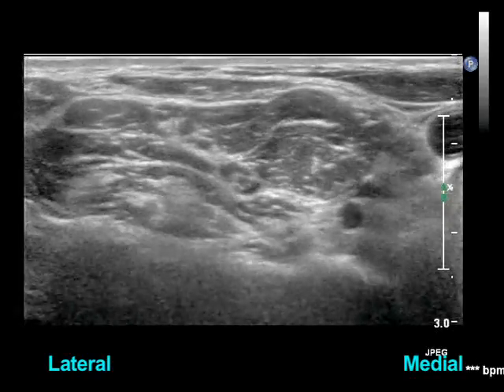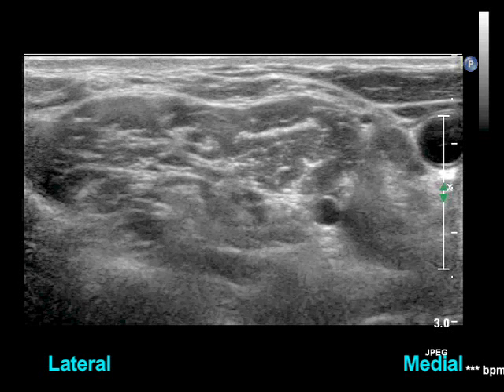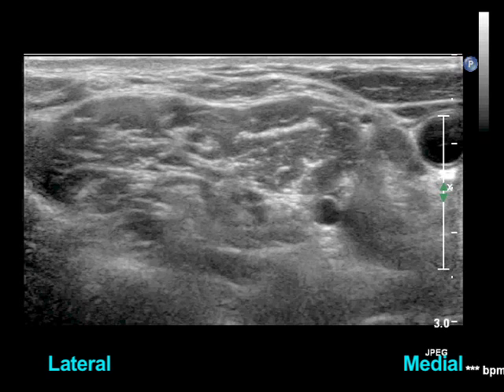The brachial plexus is formed from the ventral rami of C5 through T1. It provides most of the sensory and motor innervation of the upper extremity. Sometimes the ventral rami can be imaged as they exit their respective cervical foramina.